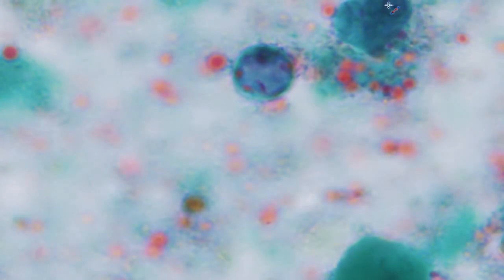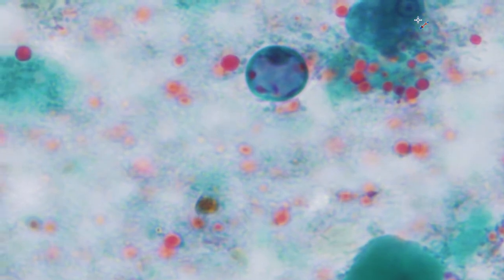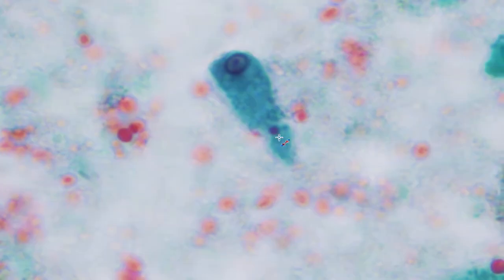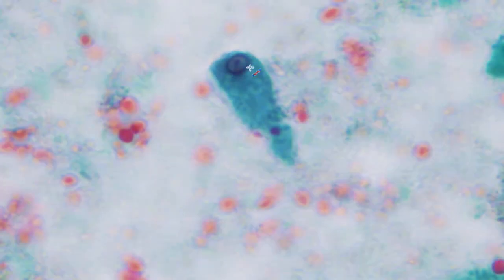Here's another very nice trophozoite as I move through the planes of focus, nice evenly distributed peripheral chromatin, almost central karyosome, not quite central, but as I said, they don't always look exactly as you would like them to. Here's a nice trophozoite that's actually been moving in this direction, and here's the nucleus again, evenly distributed peripheral chromatin, almost central karyosome. So there's some nice trophozoites of Entamoeba histolytica.